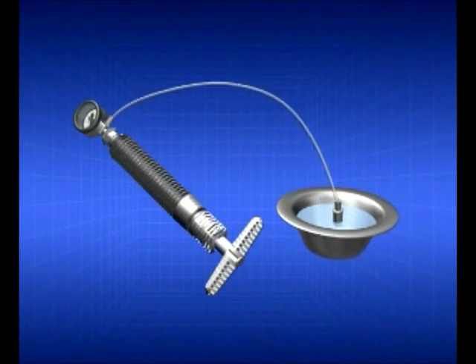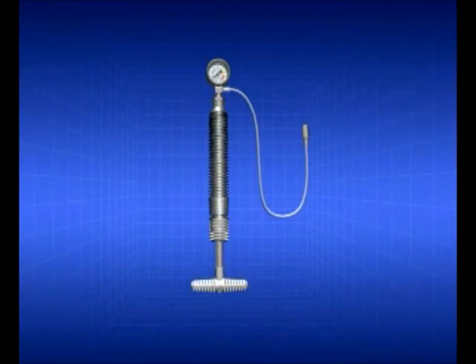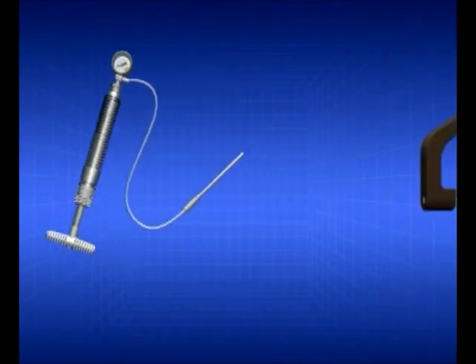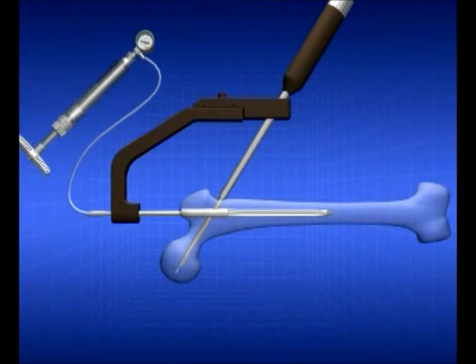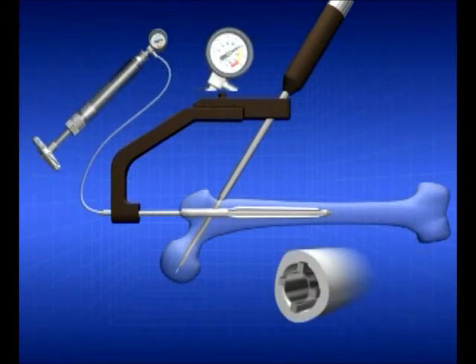The pump is filled with saline solution and air is removed from the system. The pump is connected to the nail through the inflation adapter. The nail is expanded under controlled pressure to 50 bar and adapts to the inner surface of the bone medulla along its entire length. If required, the pressure is elevated up to 70 bar.